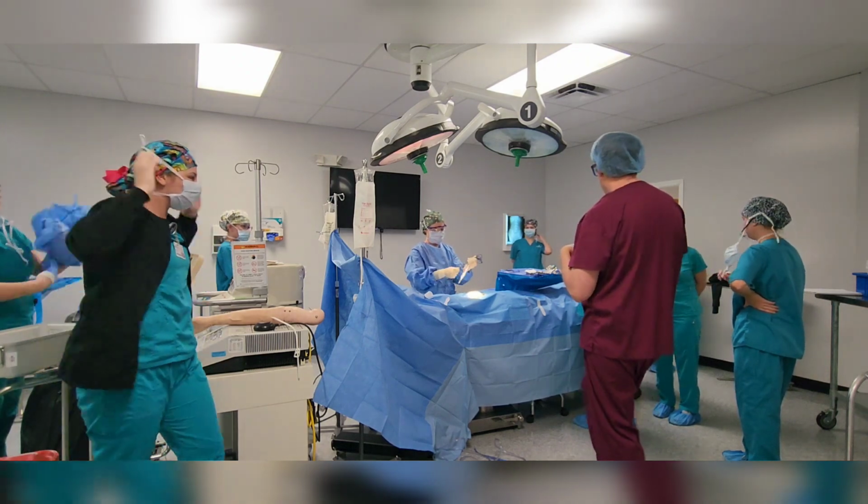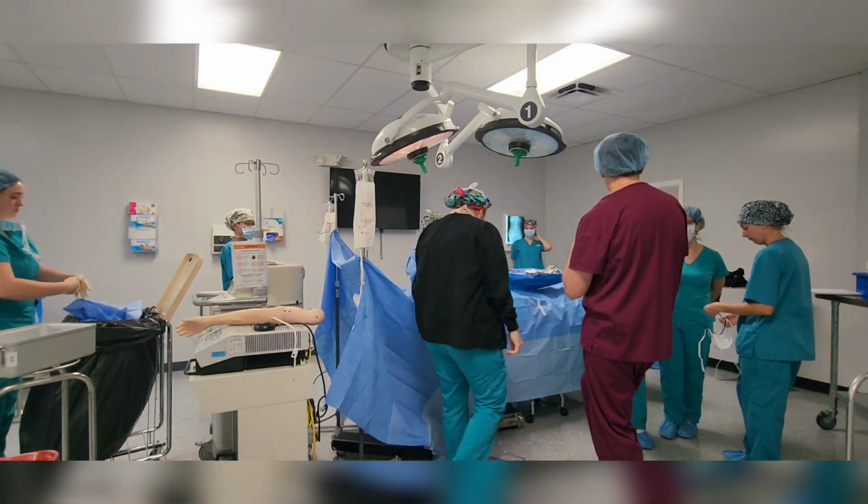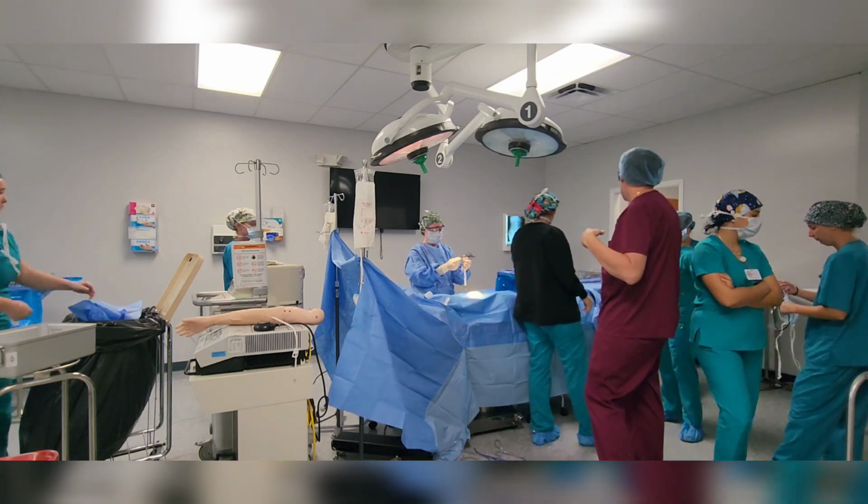It's better to start off with a simple approach, because that back table is a base, actually, and then you can add to your mayo, right?